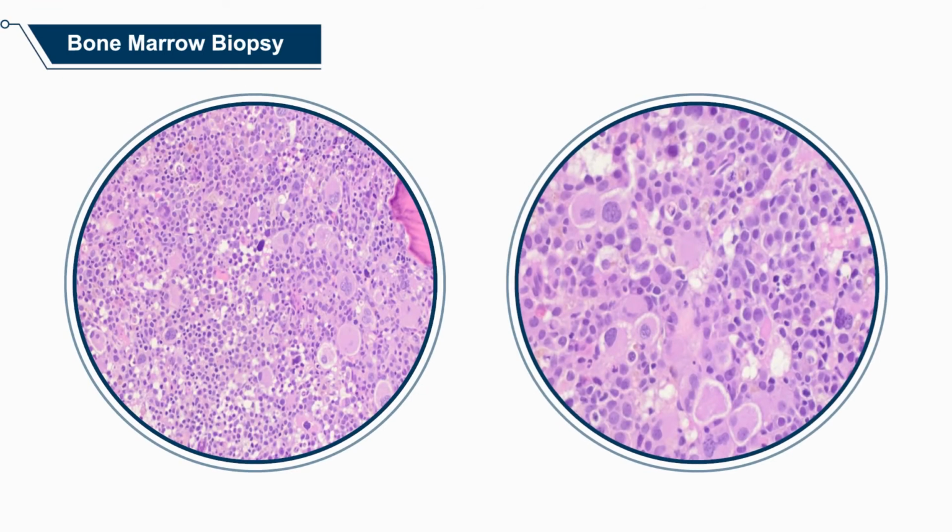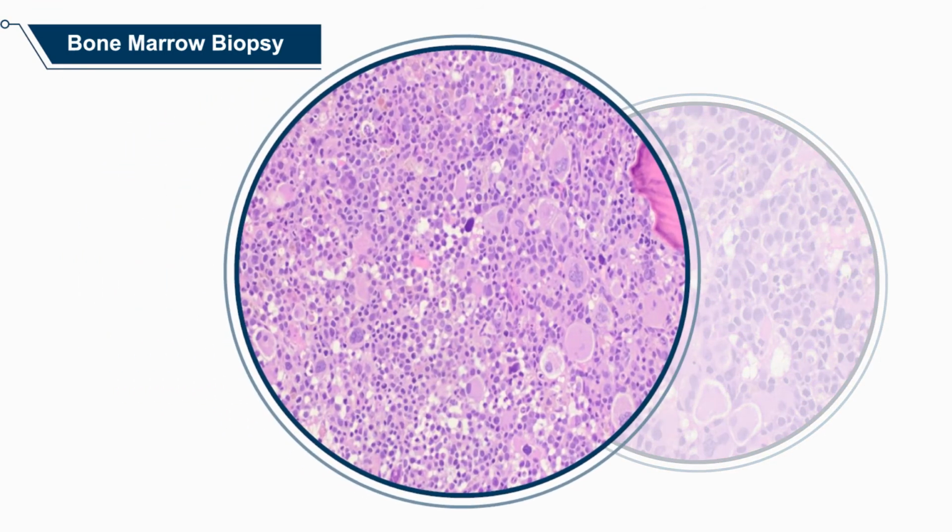This is her bone marrow biopsy. On the left side is a low-power image showing that her bone marrow is hypercellular for age. Megakaryocytes are increased here. They have an abnormal distribution because they're forming loose clusters. And then they also include these small hypolobated forms that have high NC ratio. This one here in the middle is very hyperchromatic. And so the megakaryocytes are dysplastic.